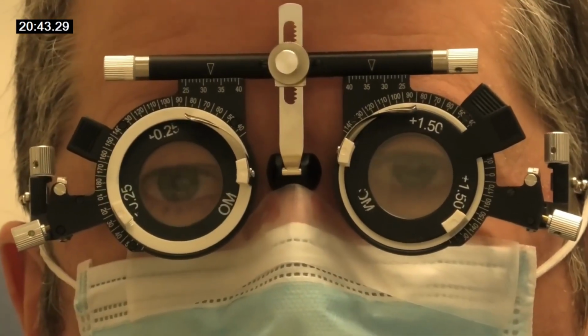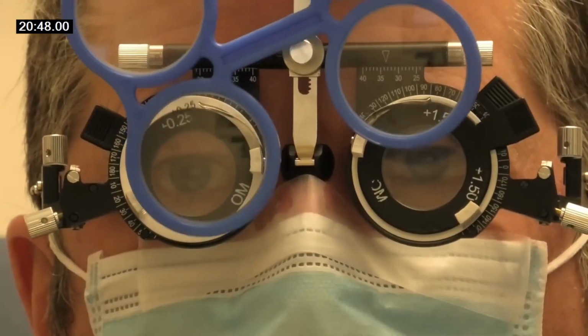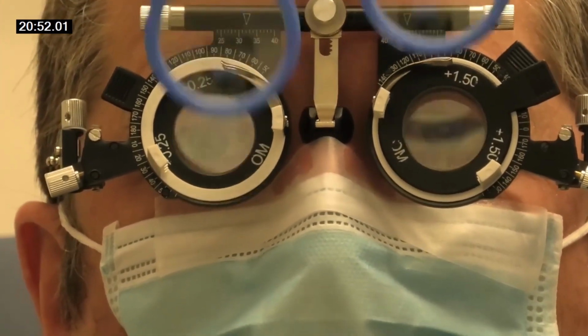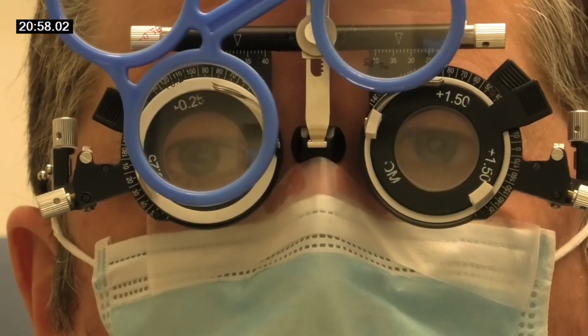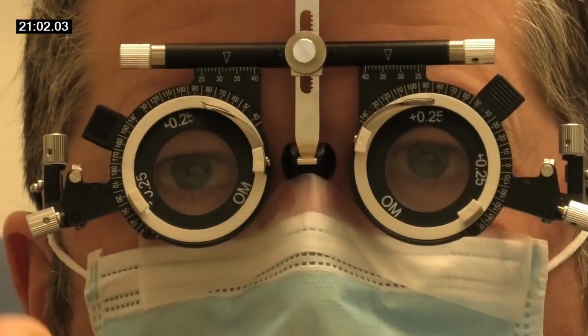Okay. Yeah. So just looking at the S again, is it clearer with, without, or about the same? Do it again. Yep, that's with. Probably clearer without, to be honest. Clearer without. Yeah. Okay, so let's go back to the other eye now.